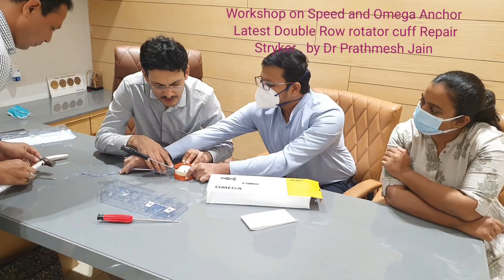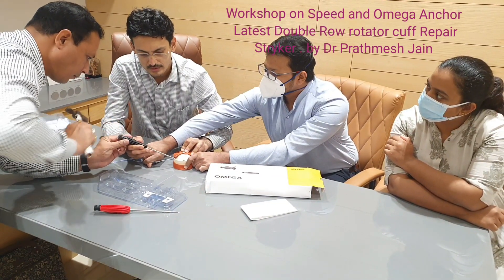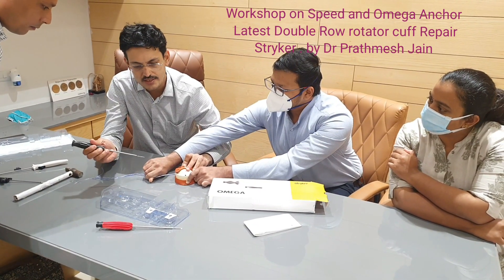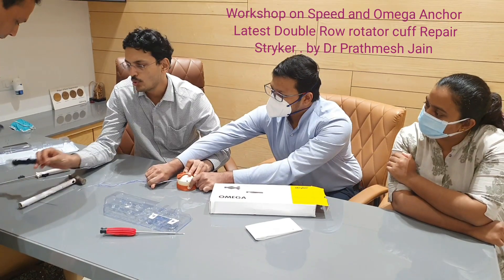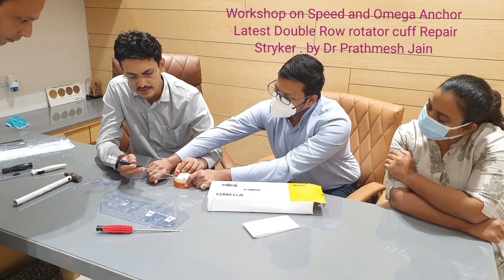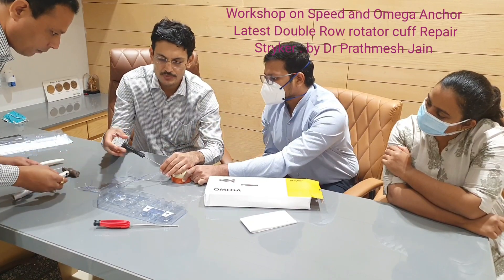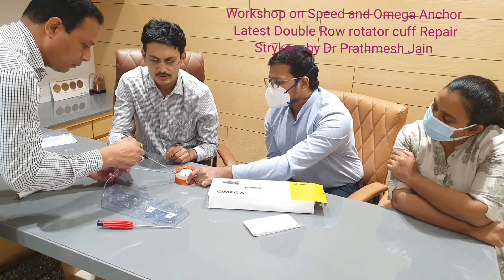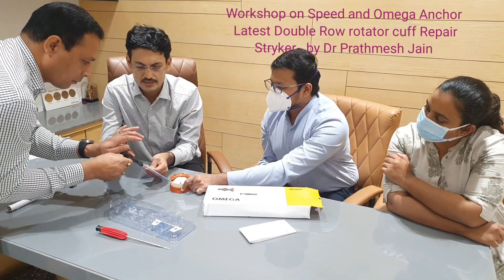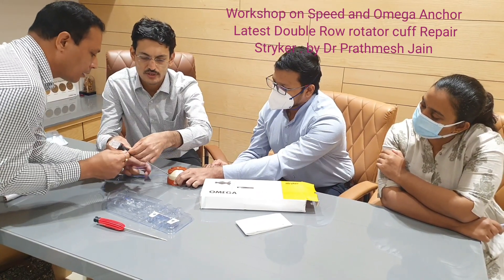Insert this up to the blackish line. Once it is inserted up to the black line, take the first inserter out. Then comes the role of the second inserting device — place it in the same hole, load all four suture tapes, and tension them over the inserter. All four tapes are now tensioned over the device.